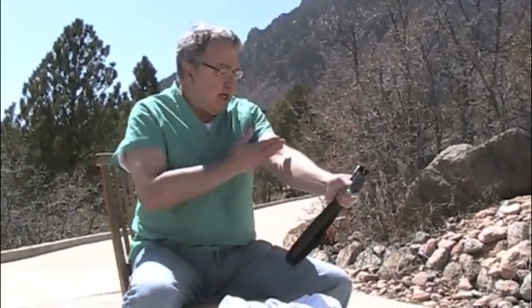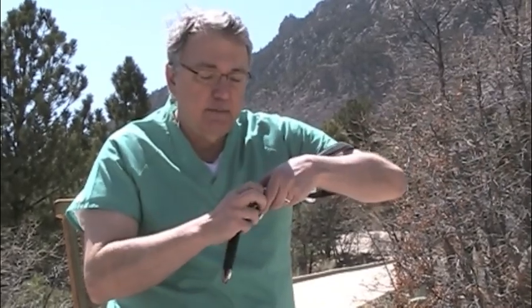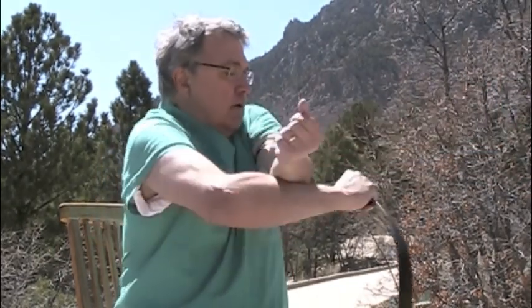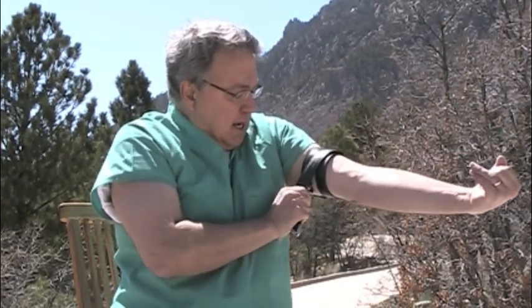So let's say we have a cut somewhere around here or here. Well, first thing you need to know is you need to put the tourniquet above the cut. I like a belt best of all. You can just loop it, tighten it until the bleeding stops, wrap it around like this, or you could put a hole in it right there, but I like wrapping it around, kind of easier, and just slip it in like that and you have a tourniquet.